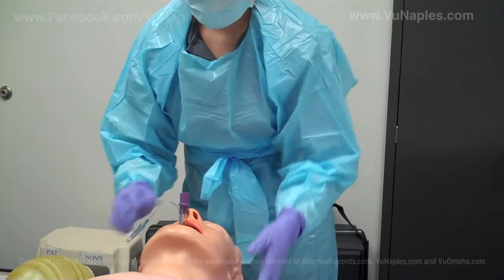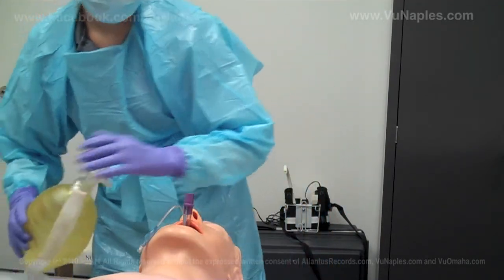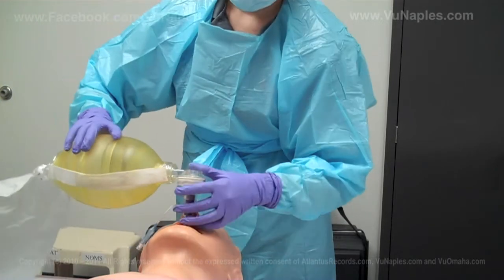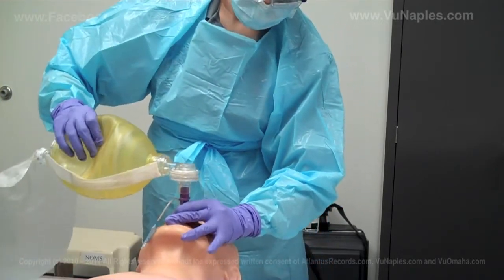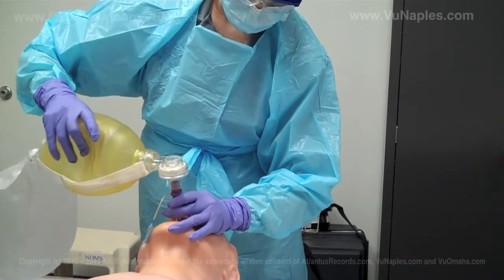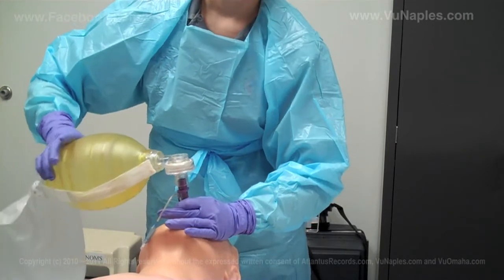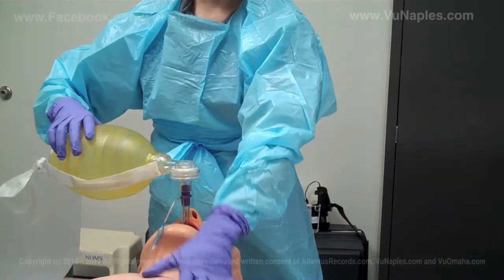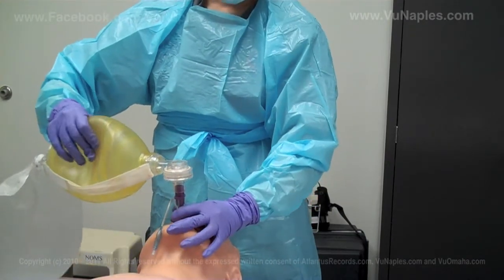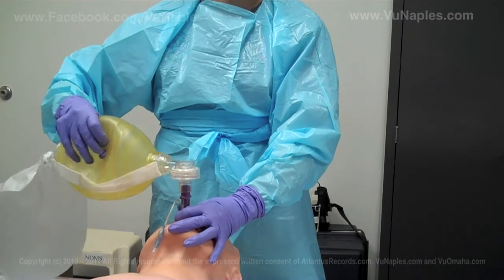What this does is block off the esophagus and open up the trachea where I can bag the patient and have an airway. I pull out on the tube slightly, and after I'm bagging the patient, I will check for lung sounds to make sure the patient's lung sounds are equal and bilateral, and then I will continue to bag the patient and stabilize his airway.